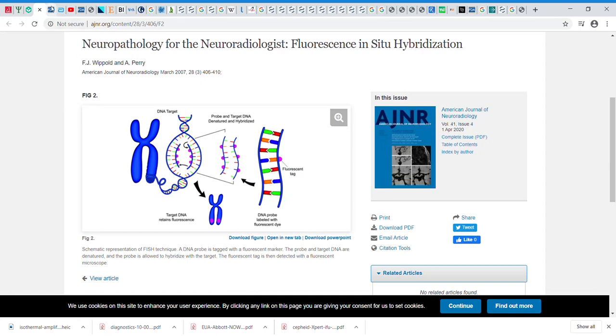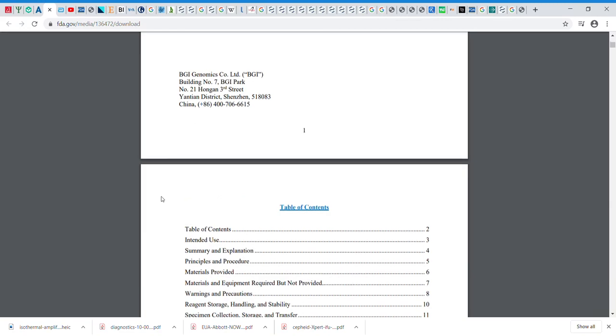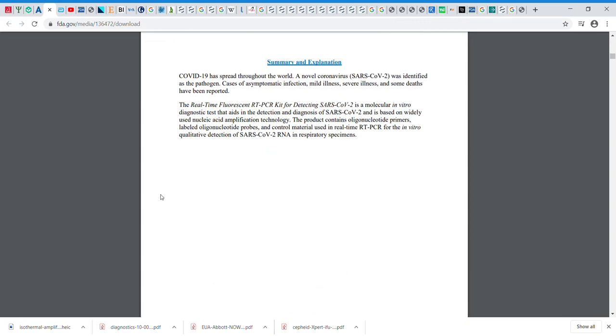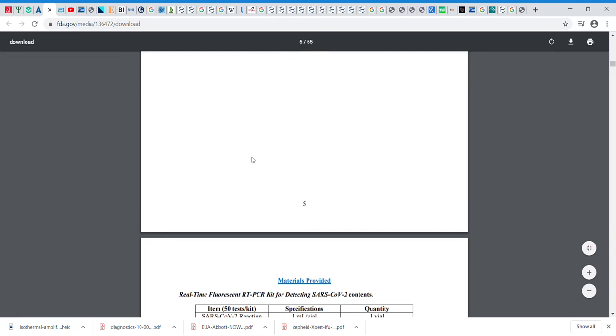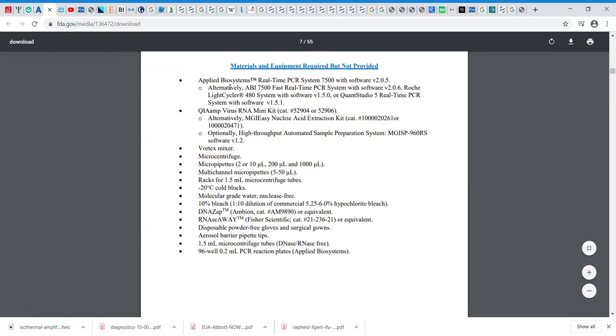So let's look at a real test. This is the FDA information for a real-time fluorescent RT-PCR kit for detecting SARS-CoV-2, 50 reactions per kit. This is very, very complicated. They go into a lot of detail. This is obviously meant for a big laboratory, like one at a big academic university. They talk about all these things, and basically, if you work in a lab, you would know how all these things work. You could have this PCR system, or you could have this PCR system.